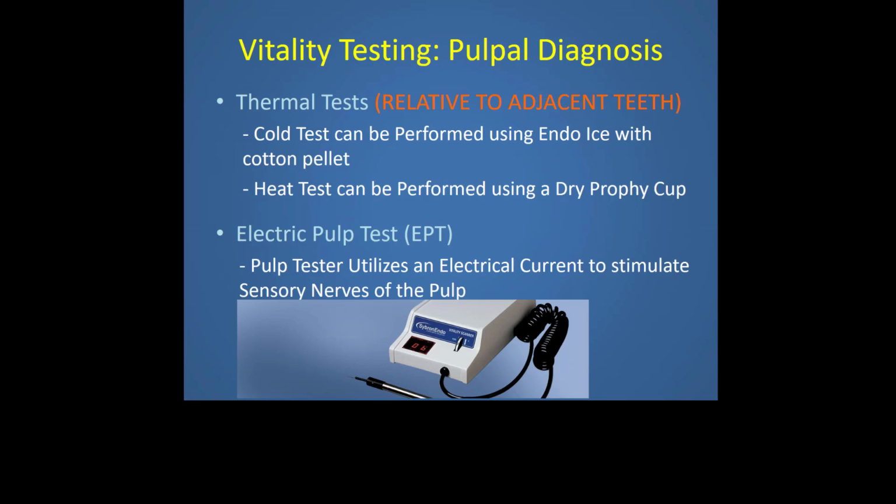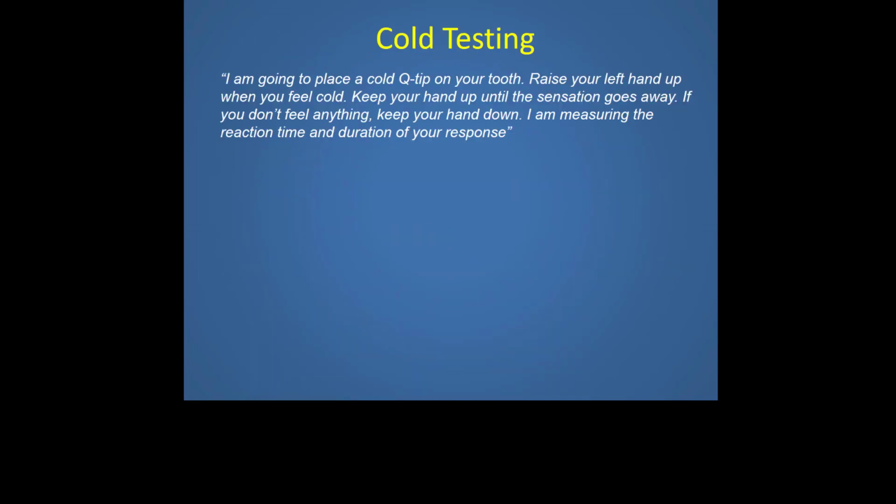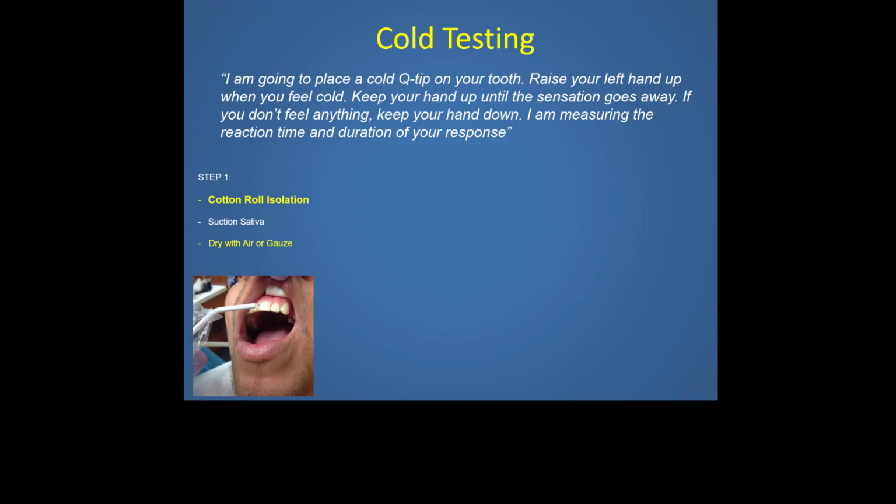Okay, when you're doing cold testing, you can say something like this. I'm going to place a cold Q-tip on your tooth. Raise your left hand when you feel cold. Keep your hand up until the sensation goes away. If you don't feel anything, keep your hand down. I am measuring the reaction time and duration of your response.